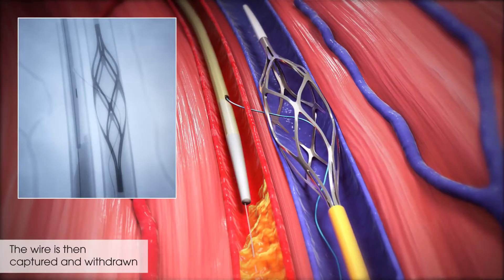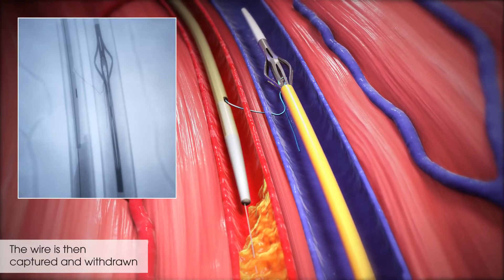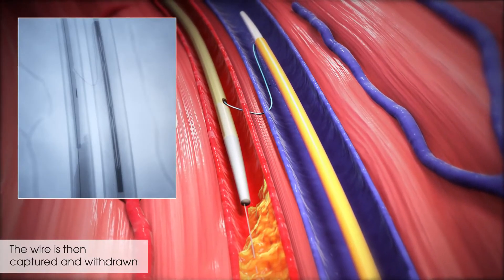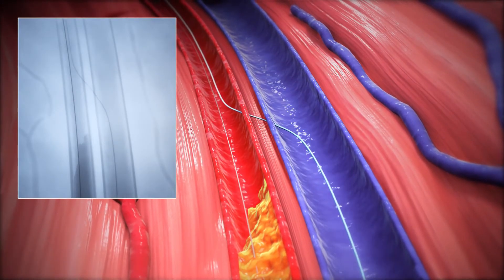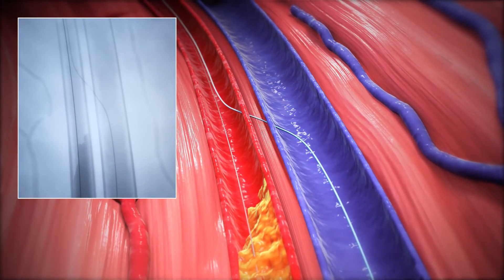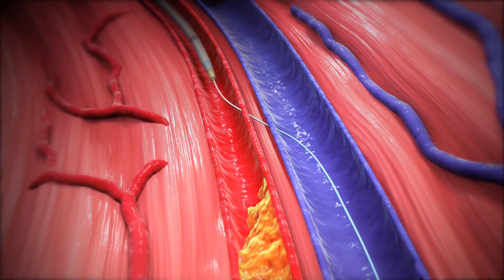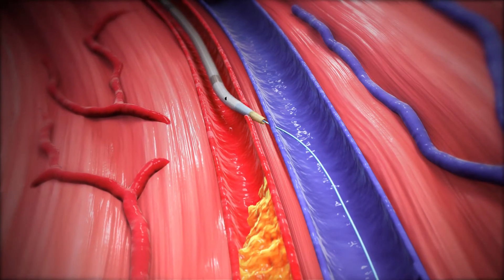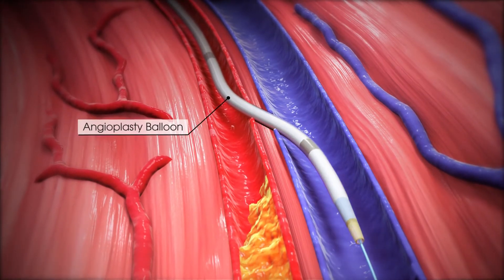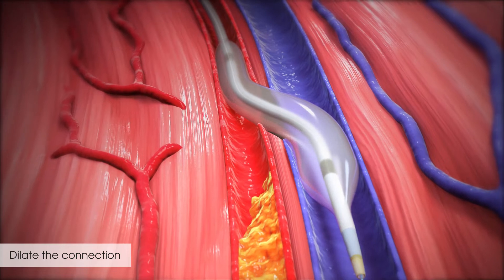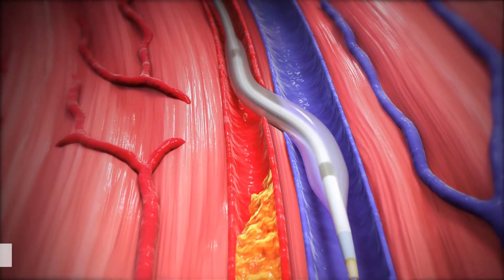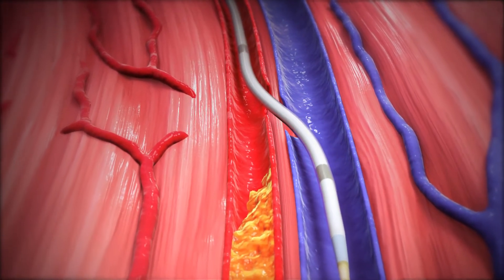The wire is then captured and withdrawn through the venous access on the bottom of the foot. A small angioplasty balloon is used to dilate the connection, allowing passage of other devices.